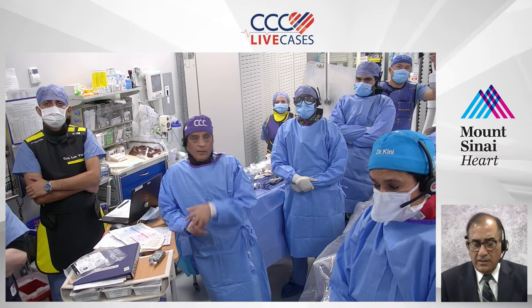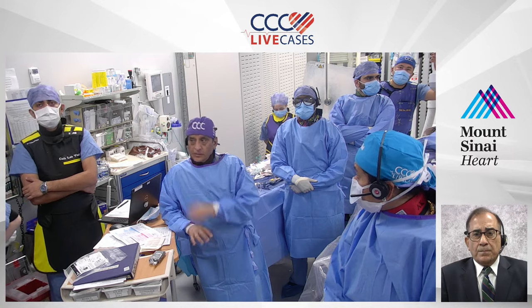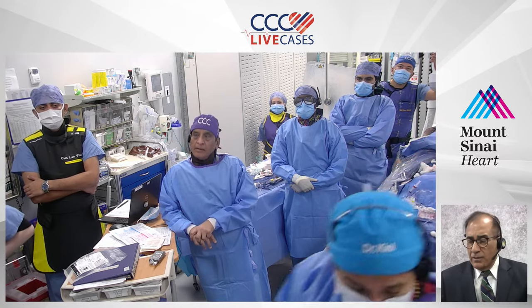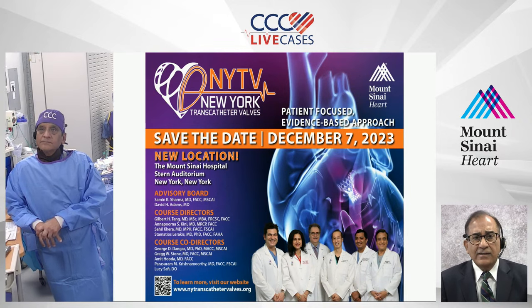Right, exactly. Anything you want to show here? But I think it has to be OCT guided. It has to be the OCT guided intervention. You want to show the last IVUS picture? Okay, all right, we are done with that. So the MLA became 6.4. Excellent case. Here is the slide.